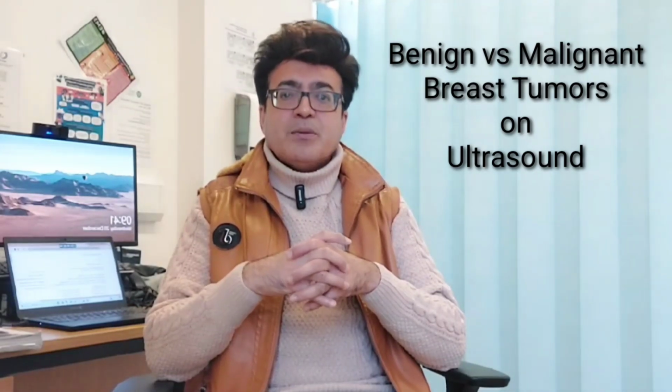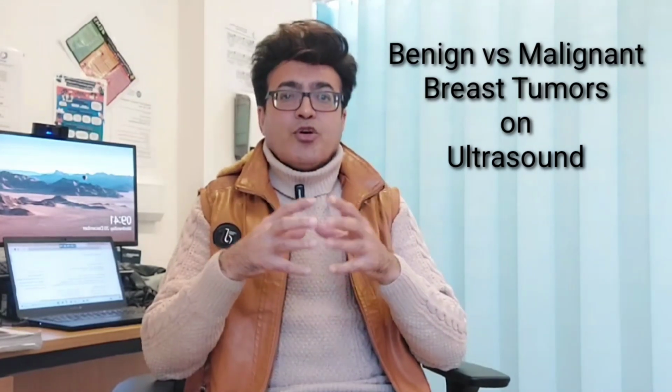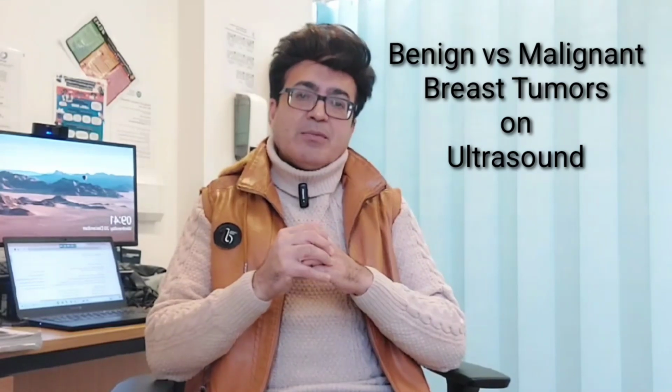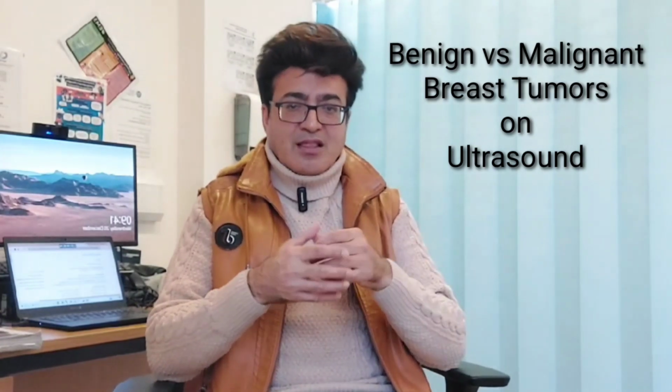However, calcification is not well seen on ultrasonography. The best modality is mammography, but still, to some extent, if you are an expert clinician, you will be able to gather all this information on ultrasound imaging. How it will appear on ultrasound and how we look for all these important points has been discussed in this video.